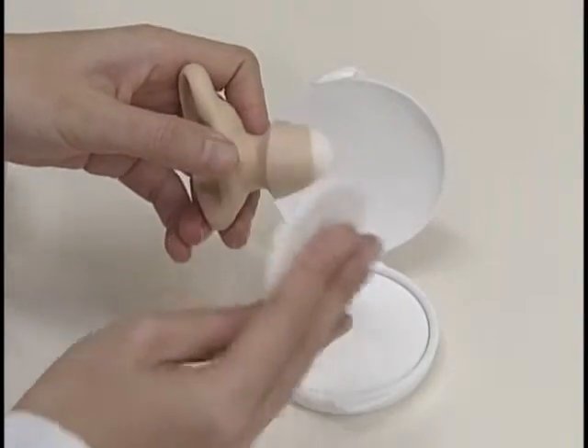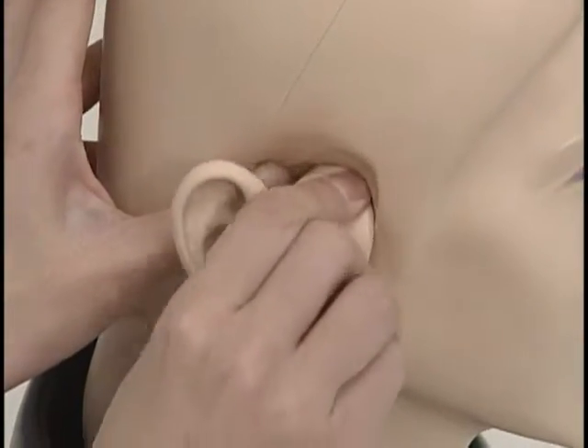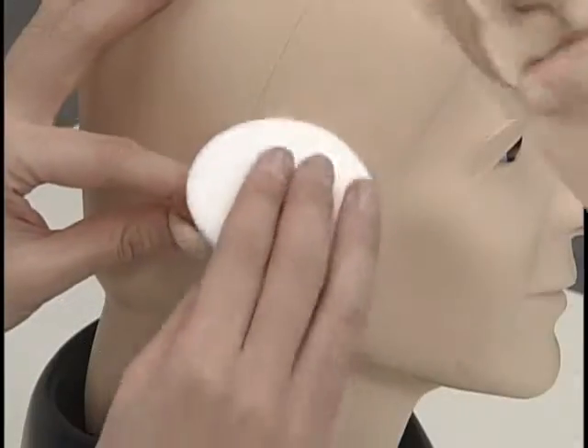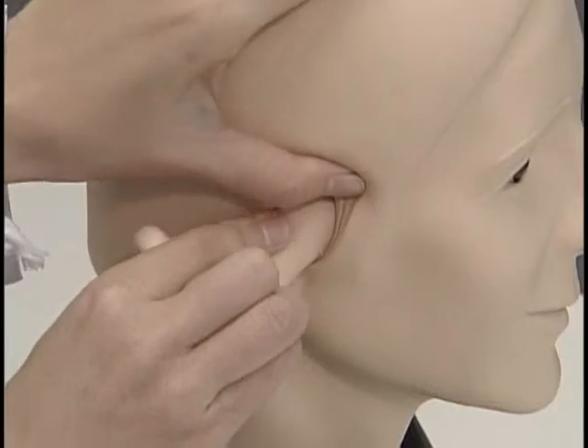Apply plenty of the included talcum powder to the earpiece and the head opening, and carefully insert the earpiece. When extracting an earpiece, first dust the base of the ear with talcum powder.